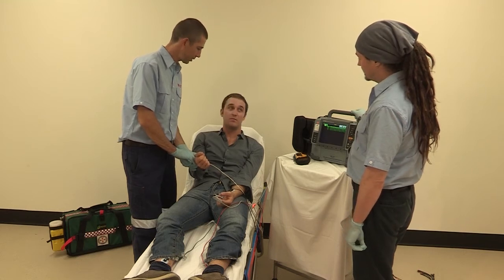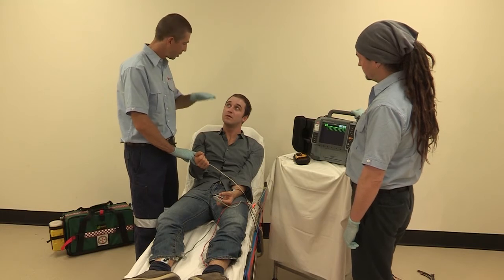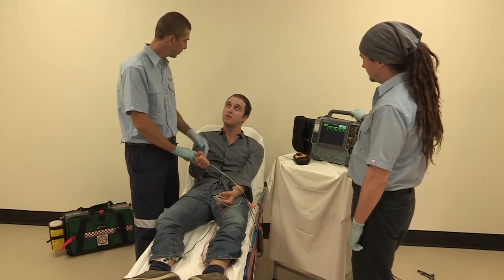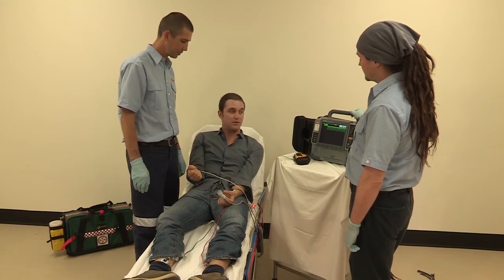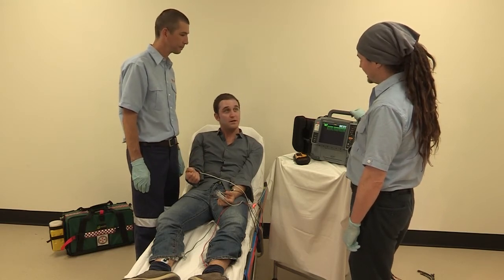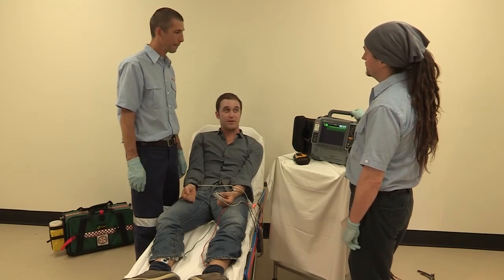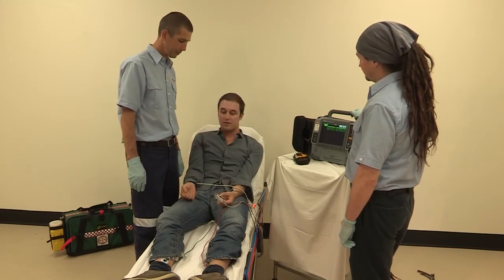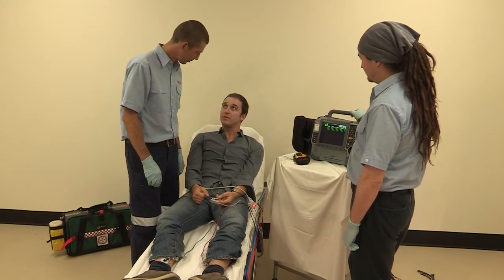As a part of preparing the patient, you will first need to gain informed consent. So make sure you explain the procedure well. Let them know what you would like to do and why, and how this will be done. Lastly, ask permission for using this procedure. In some situations, the patient may have a decreased level of consciousness. In these cases, talk to the family members present and inform them that you'll be using this procedure, as you would have implied consent.